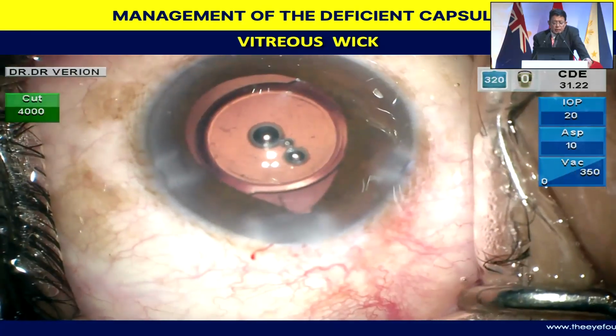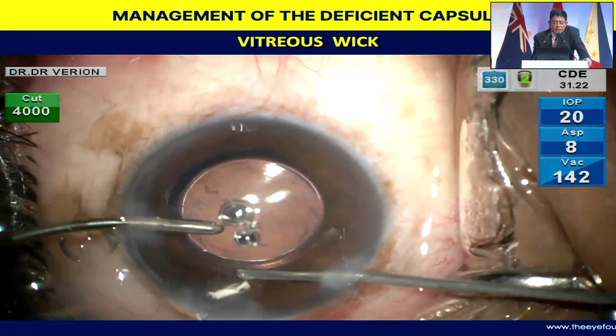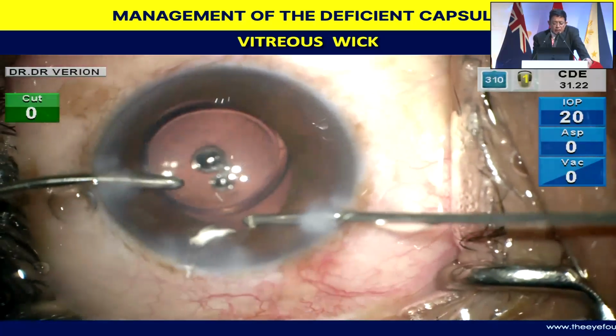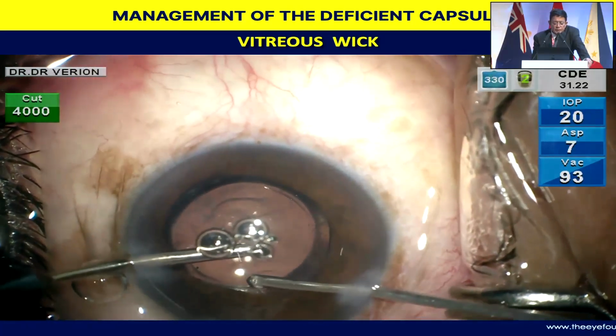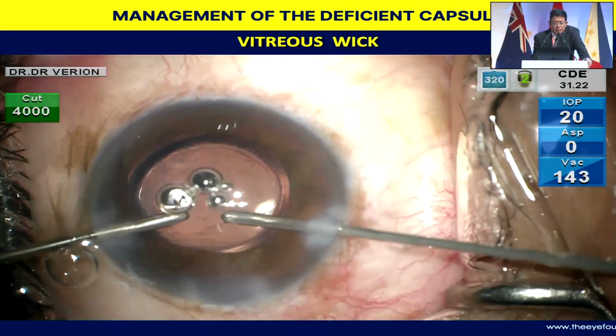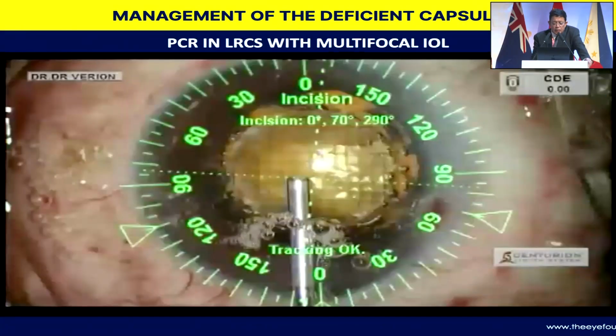Then subsequently in the subincisional area, do an adequate anterior vitrectomy. You can see the large blob of vitreous over there stained with the triamcinolone acetate. Then do an adequate anterior vitrectomy so that post-operatively, the chance of any retinal issues is taken care of. There's no inflammation, and you have the lens well settled in the bag and a good outcome.